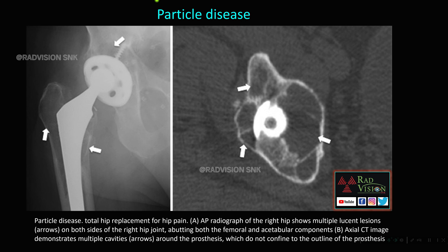Post hip replacement, lucent areas in the acetabular and femoral aspects with multiple cystic cavities adjacent to the prosthesis can also sometimes mimic tumors — this is nothing but particle disease.